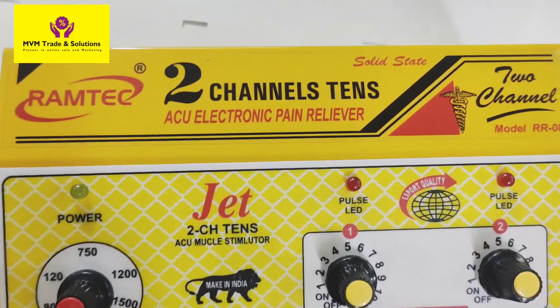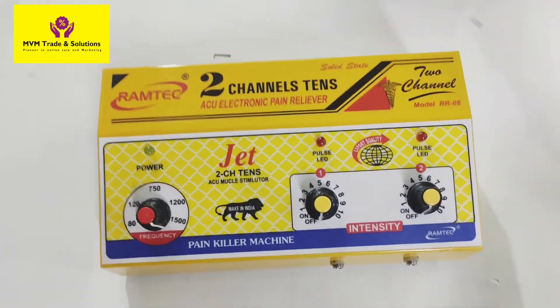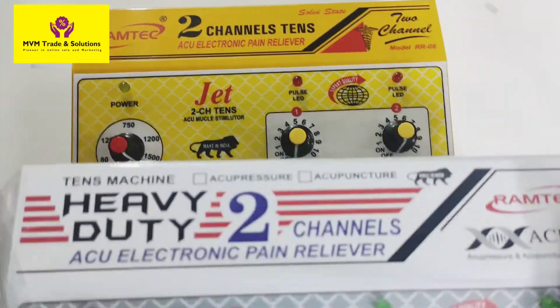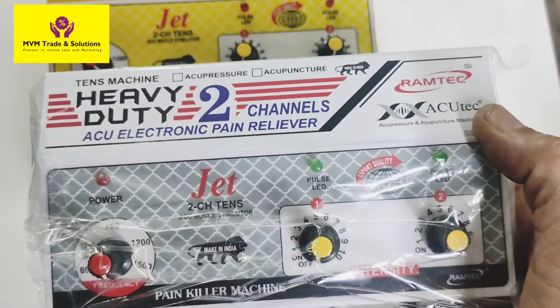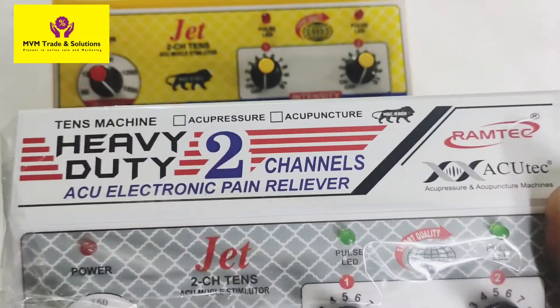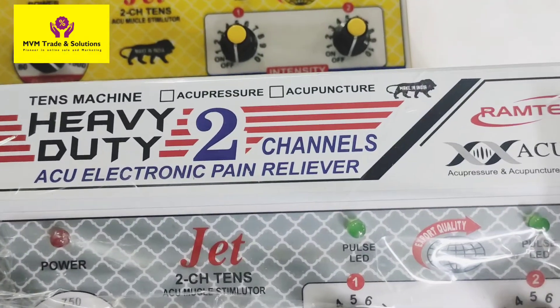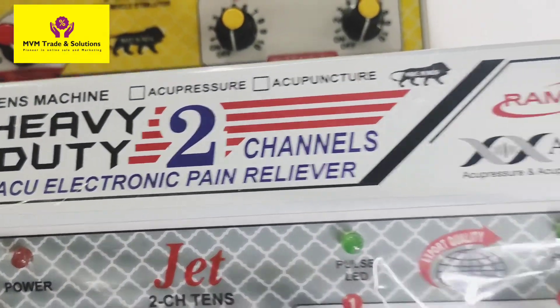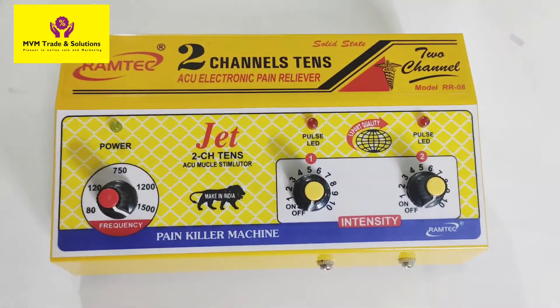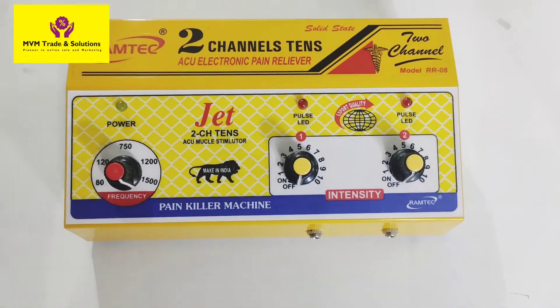You may not have put gel or the pad. First, check the TENS machine. This is Ramtech 2-channel — same machine, just a slightly different model. This is a heavy duty TENS machine, also a Ramtech 2-channel TENS machine. If you have a TENS machine, it will look like this — model RR08. Both are Ramtech 2-channel TENS machines.